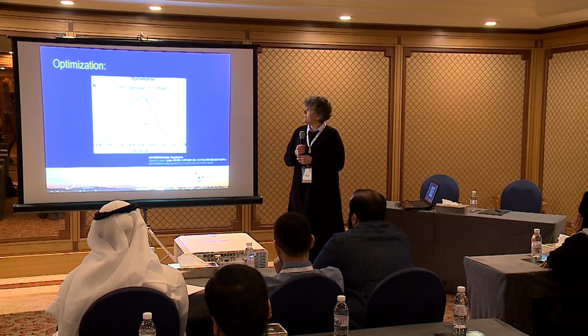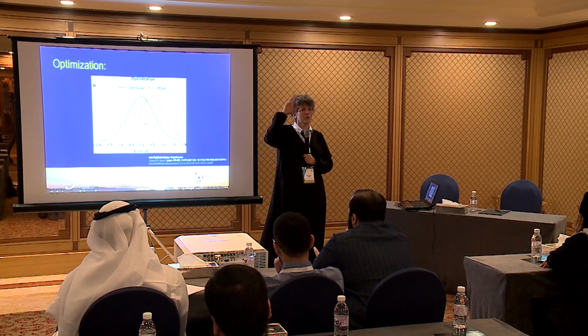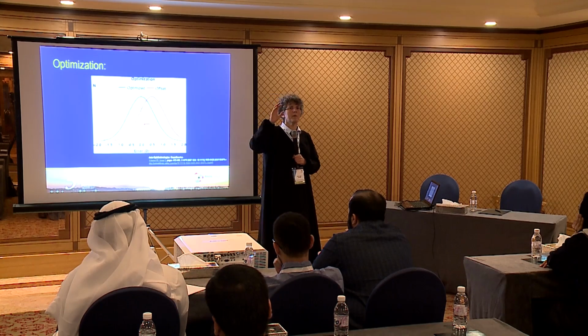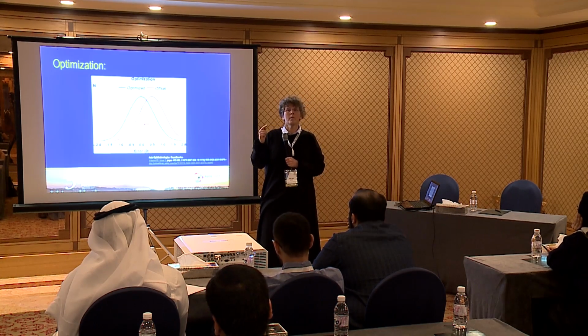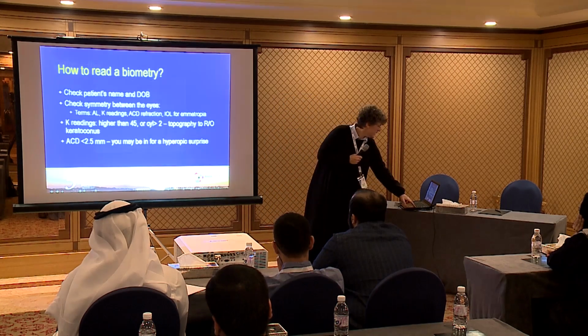Again, I took this from Olsen, and this is what he says with optimization, and it's the same as the picture with the arrows. So if you have your own set, that's the red set, and you're going to optimize it, you'll just narrow it down. You'll have the same Gaussian distribution of your results, but it will be more on target. So it's worth doing, okay?